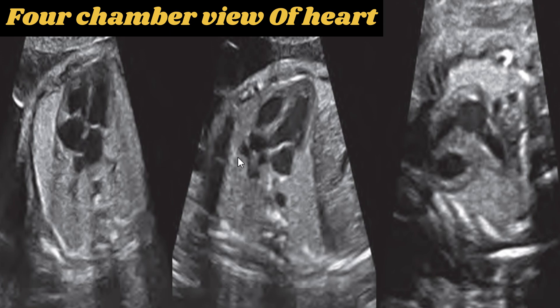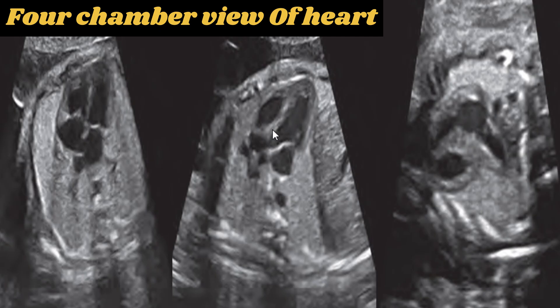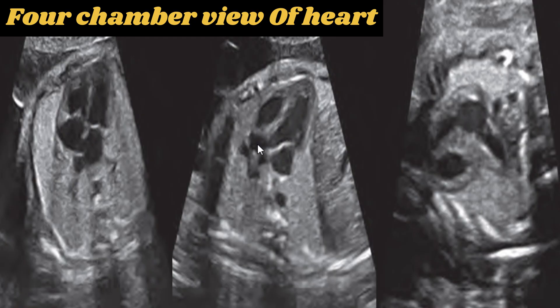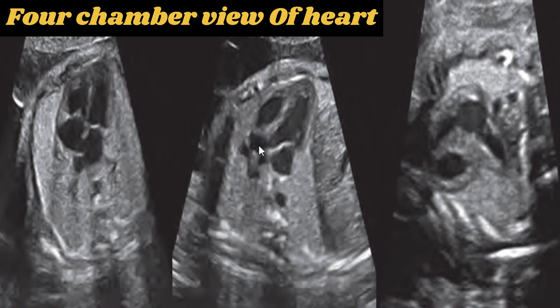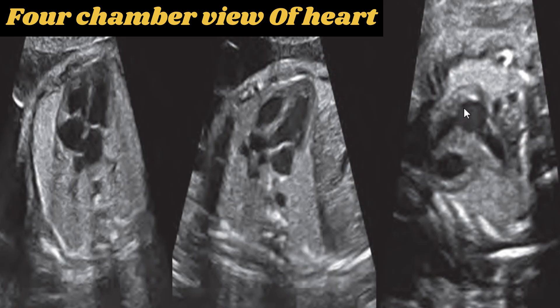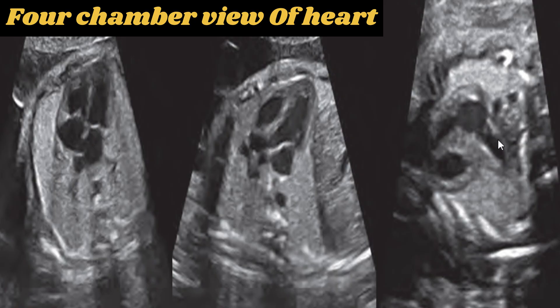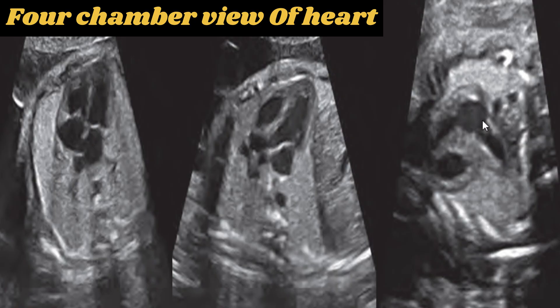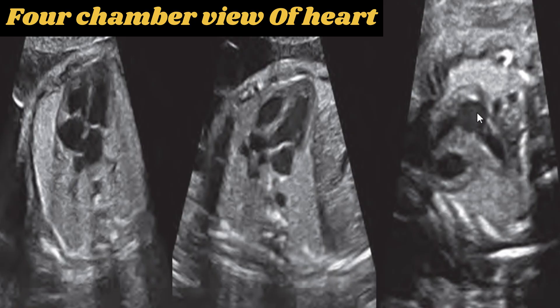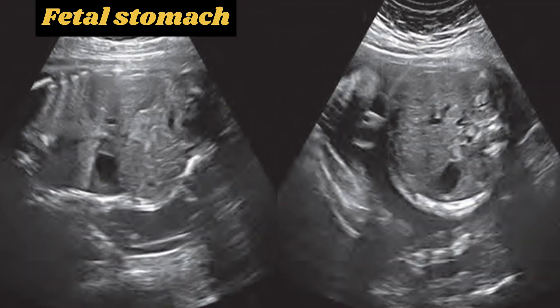In the left ventricular outflow tract view, the long axis view of the left ventricle shows the ascending aorta. In the right ventricular outflow tract view, the right ventricle is seen outflowing into the pulmonary artery, and the pulmonary valve between the right ventricle and the pulmonary artery is also visible.